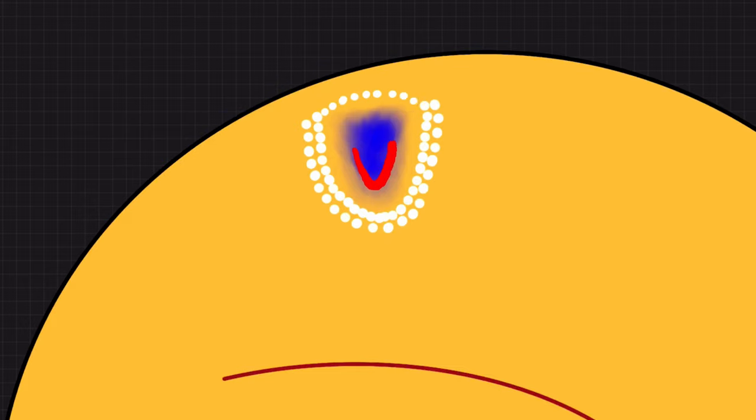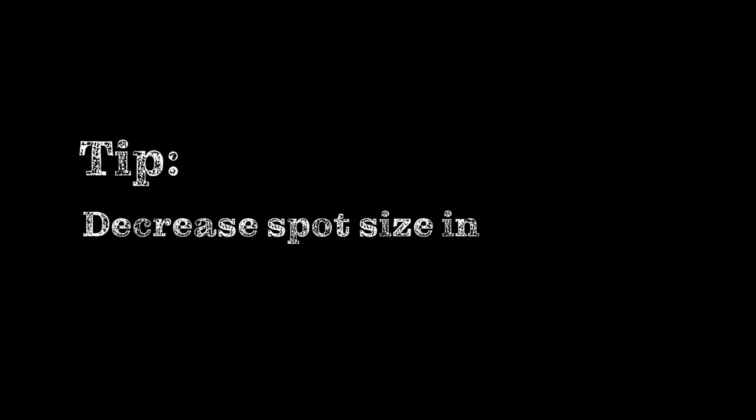So try to set at least one row anterior to the tear. If you can, it's even better to put two rows. And here's a little tip: decrease the spot size for the periphery if you're using a classic ophthalmic lens, because they distort and stretch the spot in the periphery.